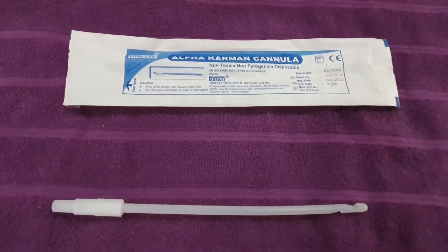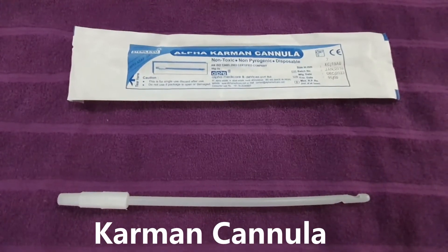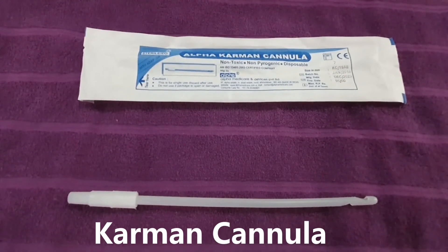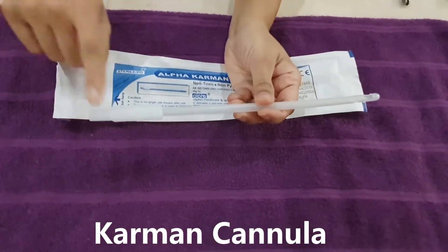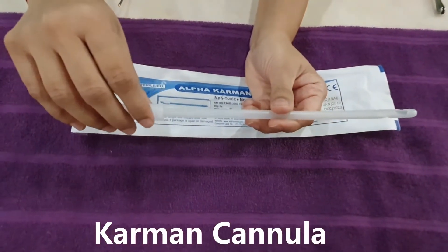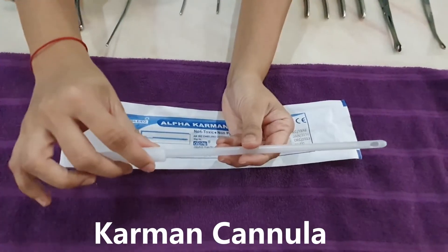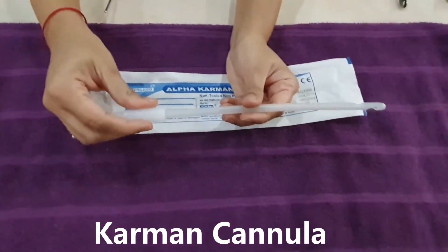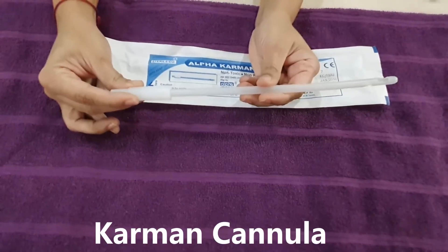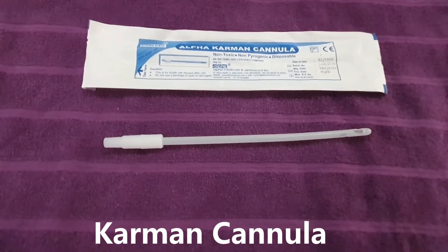Nowadays, instead of the typical DNC procedure using ovum forceps for abortion, we prefer suction evacuation, which is technically less invasive and causes lesser trauma. We use Karman's cannula for this purpose. Karman's cannula is made of plastic. We attach the suction machine at one end and insert the other end into the uterus. After dilating the uterine cavity, we rotate it and apply anterior-posterior and back-and-forward movements, which helps remove the conceptus with far less trauma compared to metallic instruments. This end also acts as a slight curette. Suction evacuation is now more commonly used for obstetric purposes.